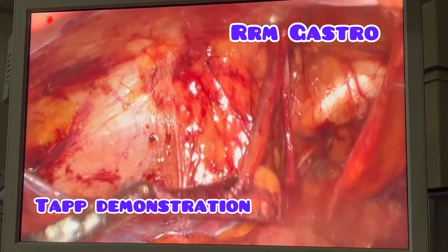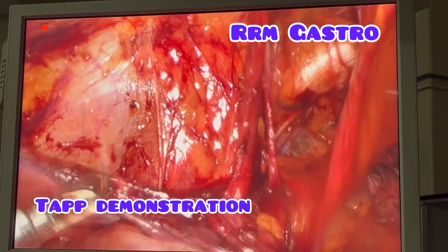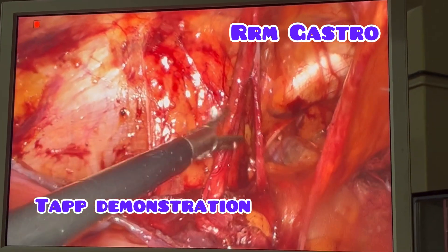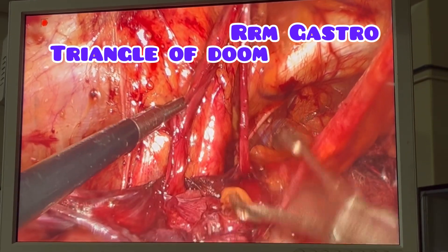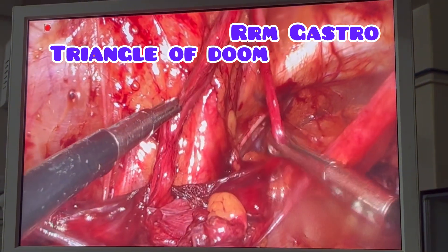Dear friends, you are going to see now a TAPP procedure — transabdominal preperitoneal repair. You can see I have raised the flap and I am now showing you the gonadal vessels. This is vas deferens.